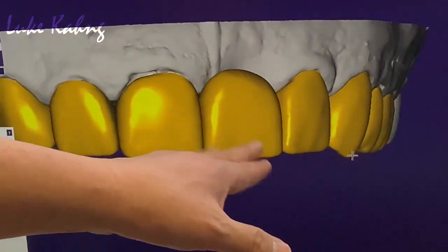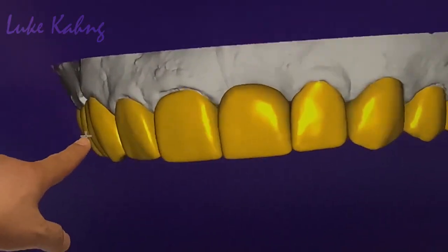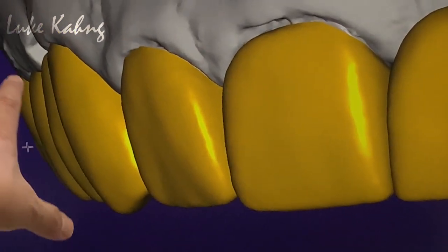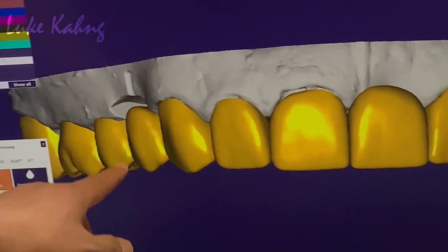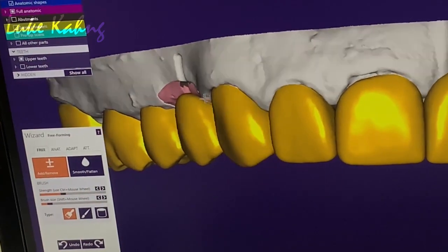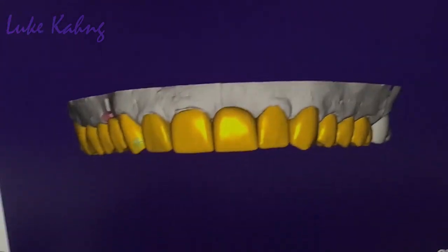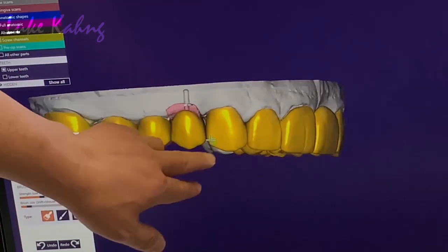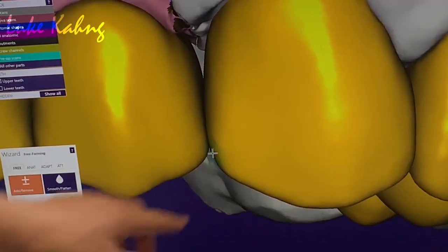Okay, let me see the buccal corridor, the other side. Buccal corridor should be fine. Okay, now this. I think it's okay. Implant. Implant, okay, good. Now you're good. Now you can take the occlusion. This is a little bit bigger, but I can cut it. Here.